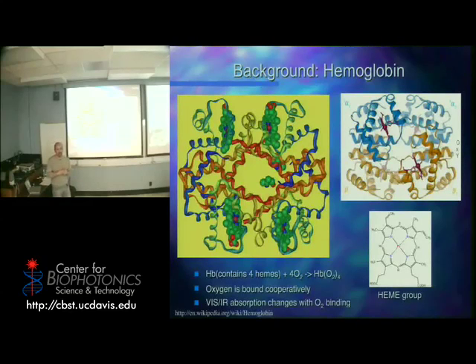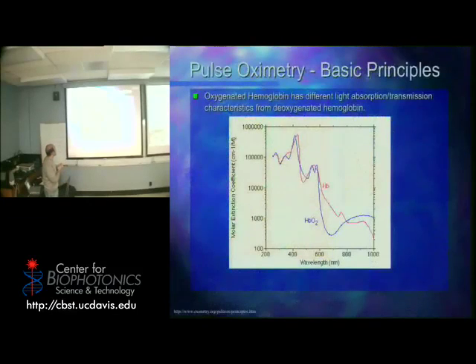And the most important thing for us in biophotonics is that the visible and infrared absorption changes with oxygen binding. Okay? You know that intuitively because if the color changes, that means somehow the interaction with light has changed. Does that make sense? And here's the proof.